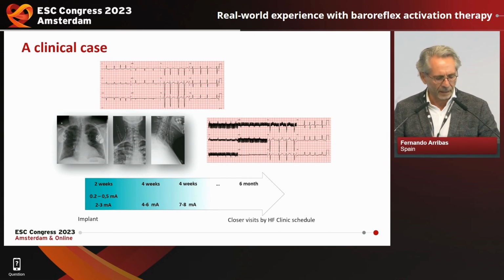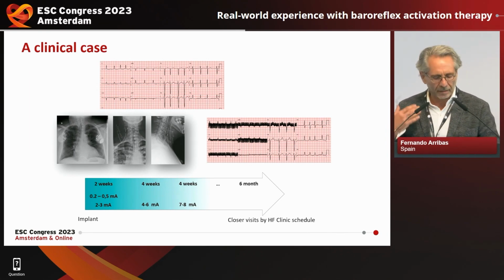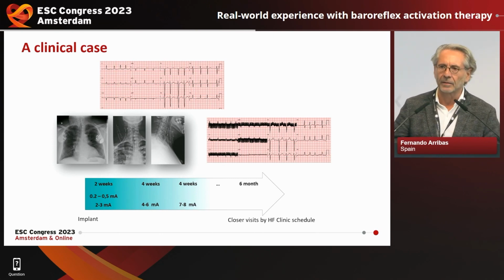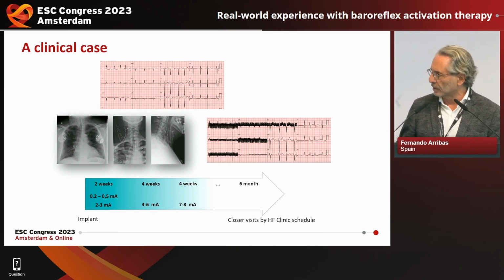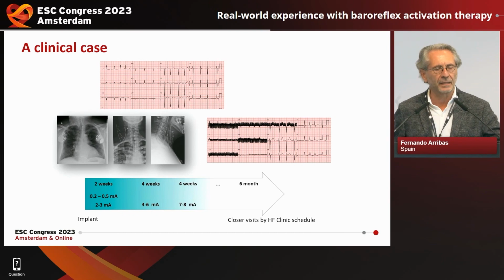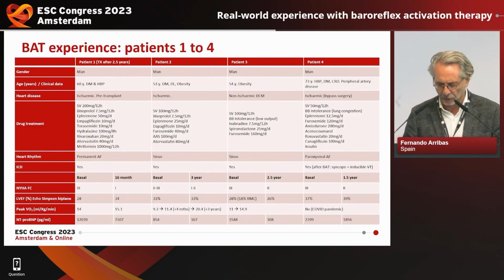Well, this is a single case. The ECG, the patient with the defibrillator, and then the device on the right side of his neck. And this is how the ECG looks when the device is doing its job. Then, the second part is done by the heart failure specialist after a couple of weeks. The device is optimized in order to get more benefit from it, and it's done in the heart failure clinic. It takes time, but not so much, because our patients are visited more than what is imposed by the protocol of optimization.